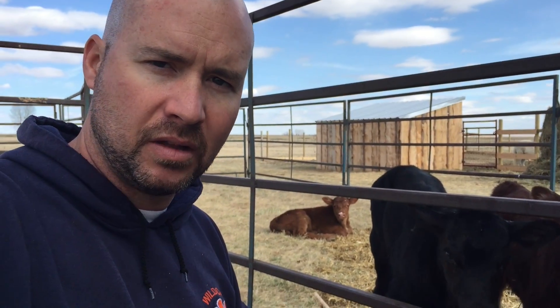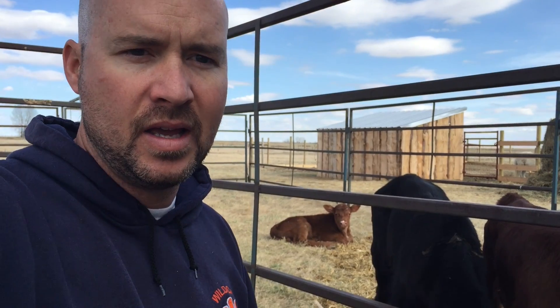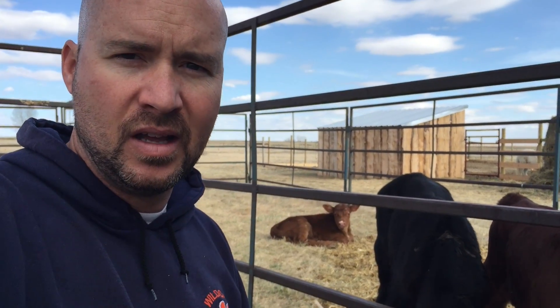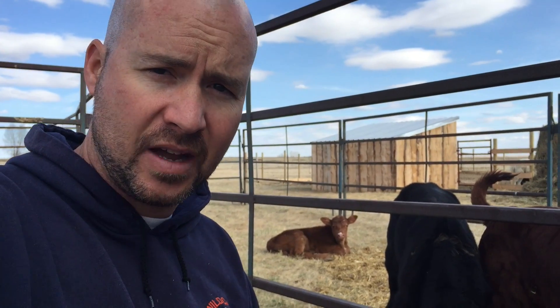Even last night she was drinking really well and she's kind of lost interest, and she doesn't have a good sucking reflex anymore. She also has really bad diarrhea, so we need to get a lot of electrolytes in her. Without her sucking, the way to do that is to actually tube her — you take a special bottle with a long tube on the end with a bulbous tip so it doesn't hurt going down — and basically send that all the way down their throat and right into their stomach to fill them up with fluids, electrolytes, and milk replacer if needed.